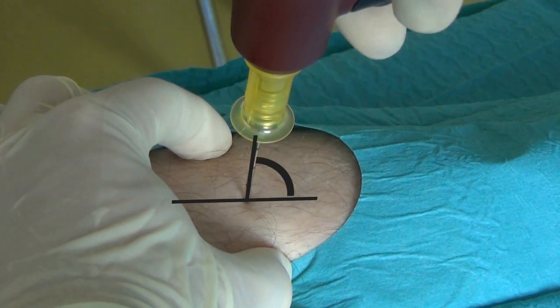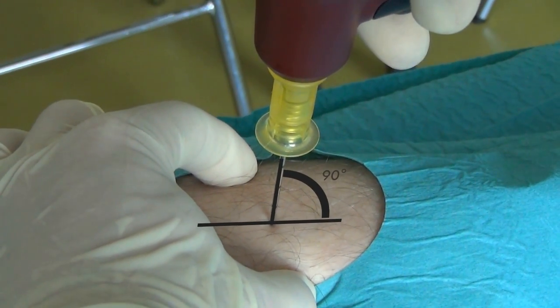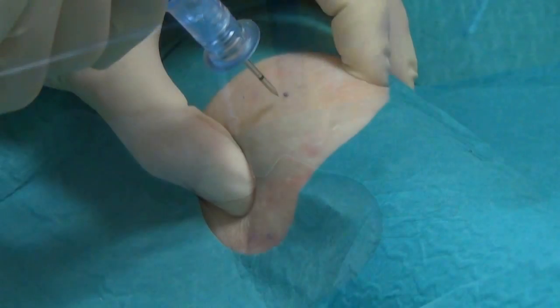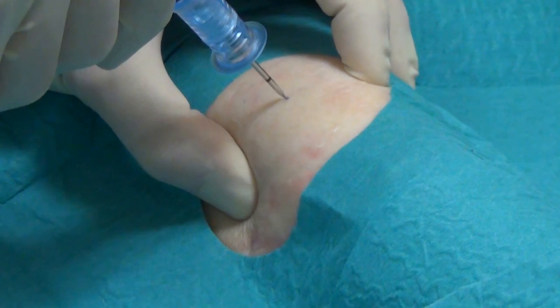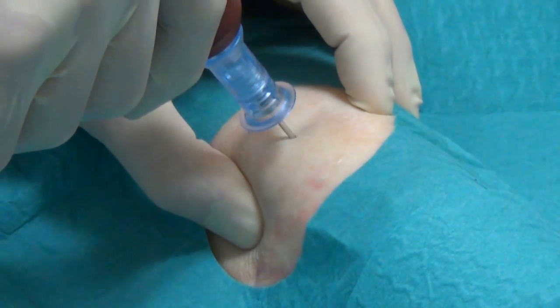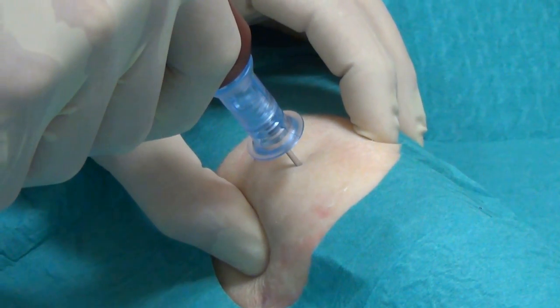Insert the intraosseous needle with a mechanical device perpendicularly to the flat surface of the tibia until loss of resistance.